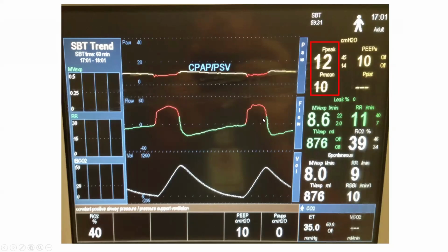Now remember the 12, you're getting the 2 because all these ventilators have 2 to 3 centimeters built into them because of the airway resistance of the ET tube. So you see here when it increases upward, you get that 2 to 3 centimeters. All the ventilators do it. The Servos, the 980s, all of them have that on there. That's why when your P high is 26 and your total pressure is 28, 29, that's where that's coming from, the machine. That's why you don't need to use any pressure support, because it's already built into the devices.